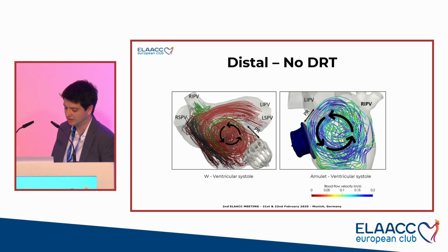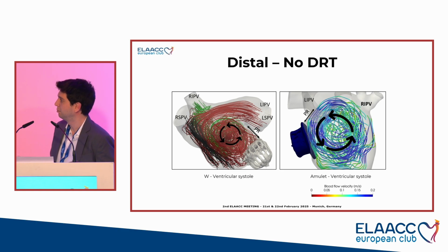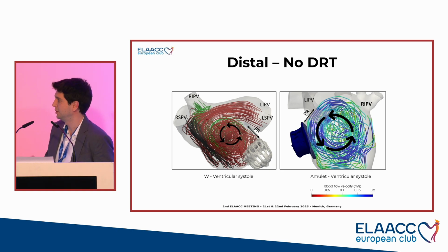So here my point is, okay, you can place it distally. If your patient is in sinus rhythm, it's okay, or it can be okay, but perhaps if this patient develops permanent atrial fibrillation, we can have a problem here.